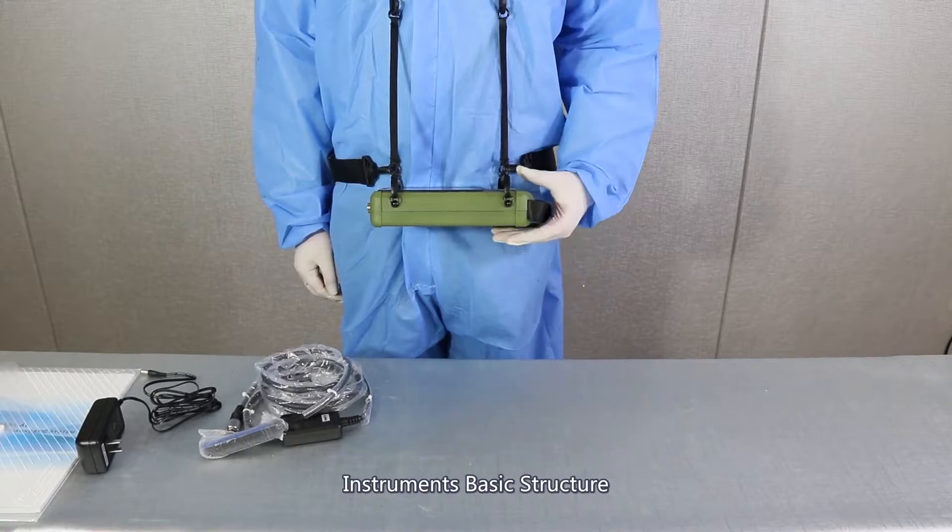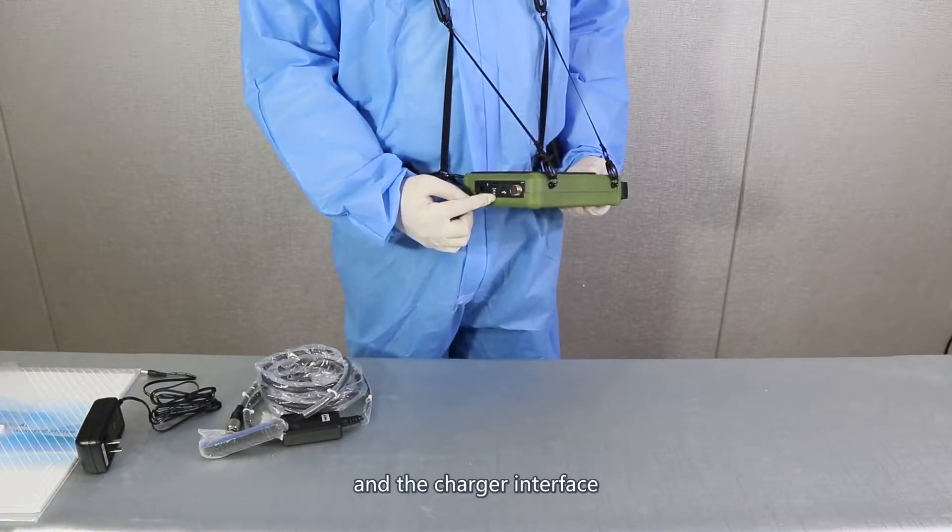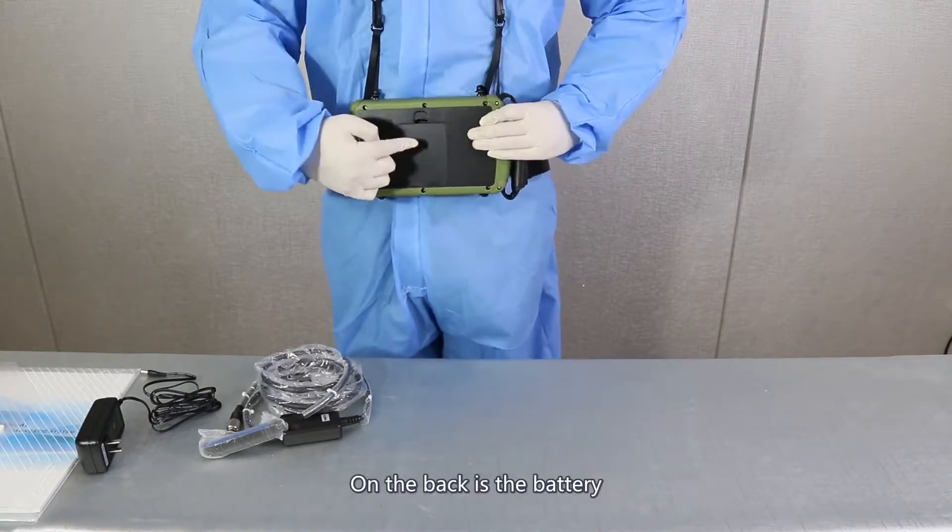Instrument basic structure. On the left is a probe interface, USB port, TF port, and a charger interface. On the back is a battery.